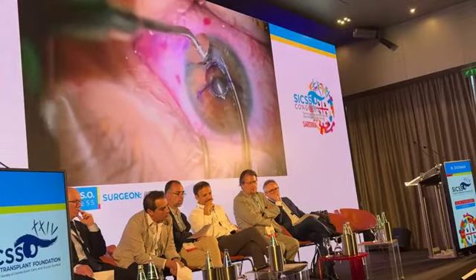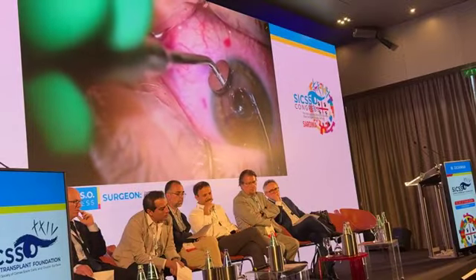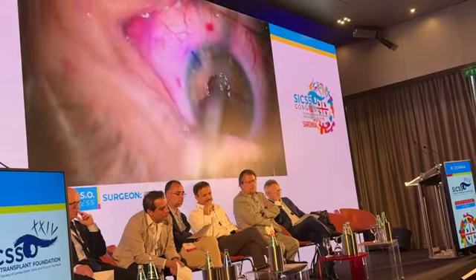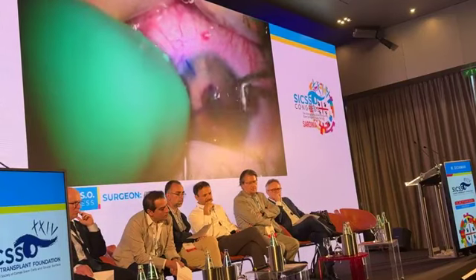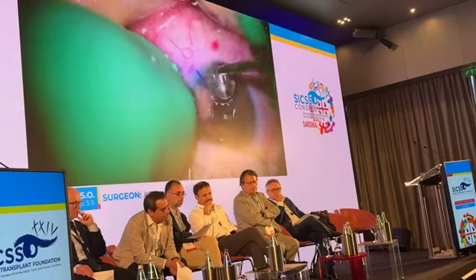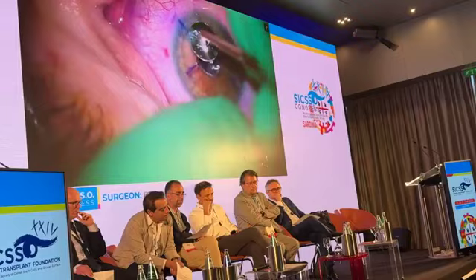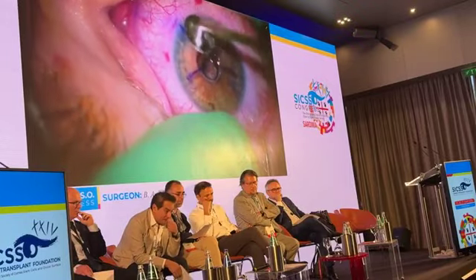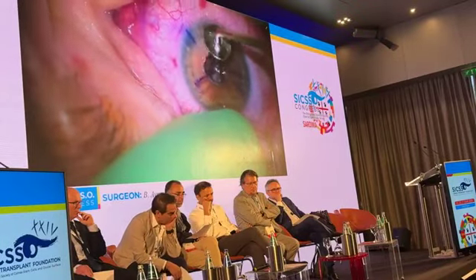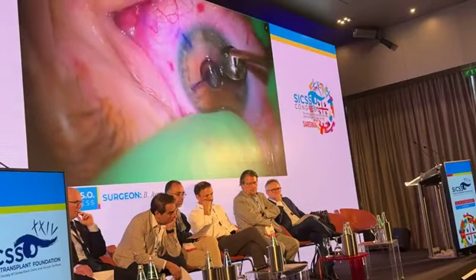There we go. So now we've just about hit our mark, so we know that we're all the way on one side, and now we'll smooth out the other way, and we should be pretty close. Yeah, we're right on it. There we go. Hunter, just look right at those lights for me. I like to put a fair amount of pressure with this little smoothing ball to really make sure that that segment is all the way unfolded in the channel.